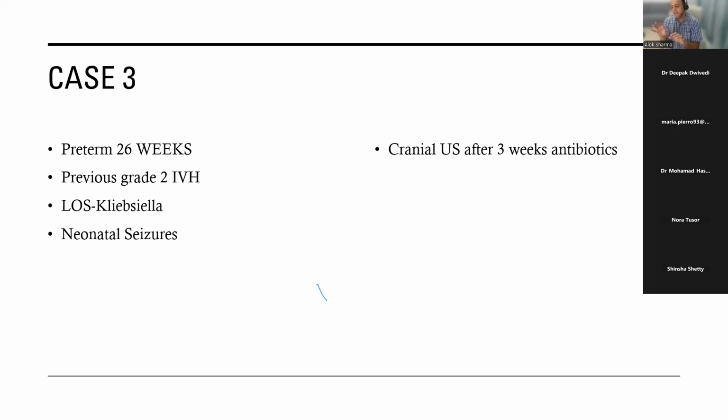What I'd say is that on ultrasound, the answer is no, you can't. The only way that you can really determine whether the baby's got pus is by doing a CSF and demonstrating that you've actually got pus, or by doing an intraventricular tap, because even an MRI might not be able to give you that information. So the nature of exudate is always determined by actually physically sampling.